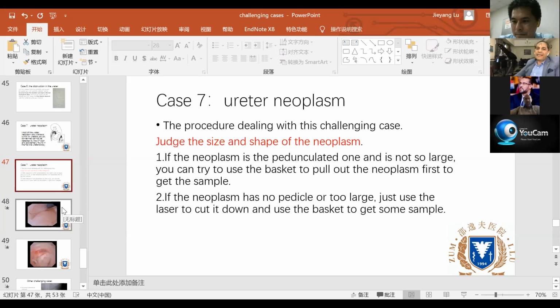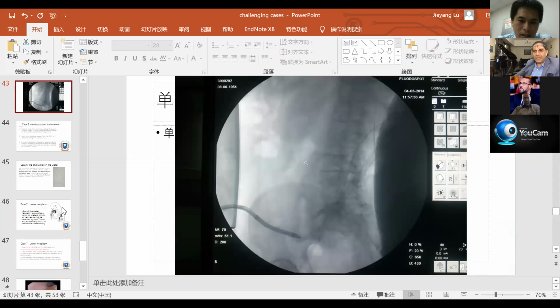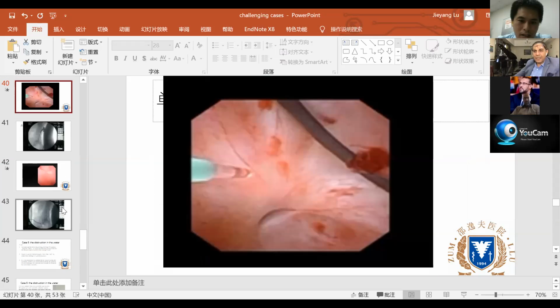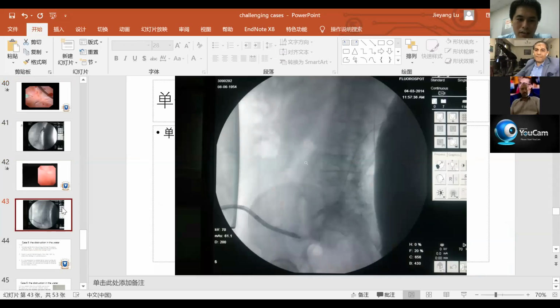Okay. I will come back to the case of ureteropelvic junction obstruction. It's what you did by flexible ureteroscopy, a kind of endopyelotomy, whether by laser or by electrocautery. Yes, we have cases by laser, and we tried all kinds of instruments. First, we do lasers in cases where the obstruction place has stones, so we can treat both the obstruction and the stones together.